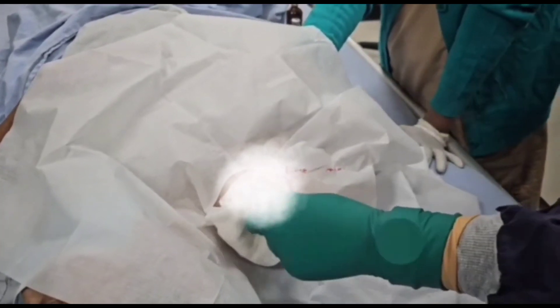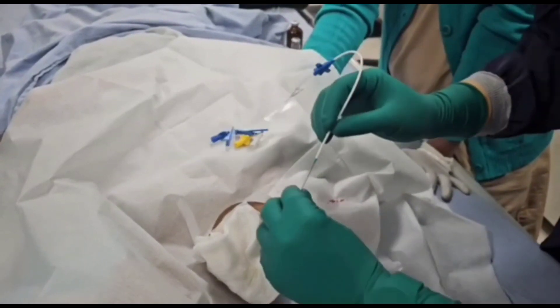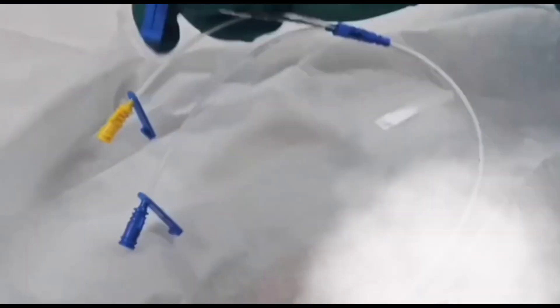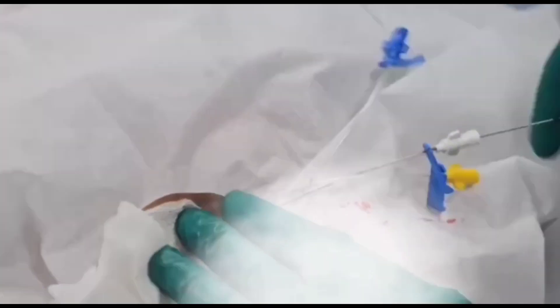Finally, we introduce the central venous line over the guidewire. This technique is called the Seldinger technique, named after its inventor Seldinger. We then advance the central venous catheter into the subclavian vein.